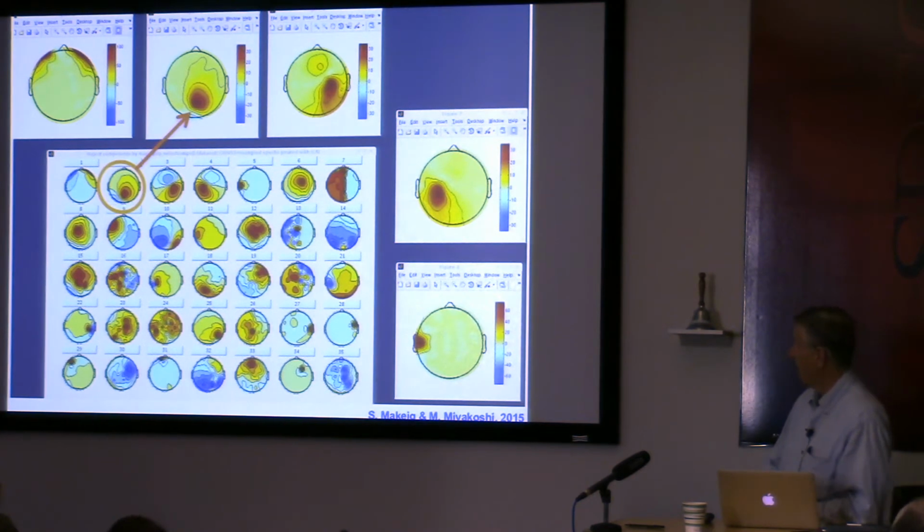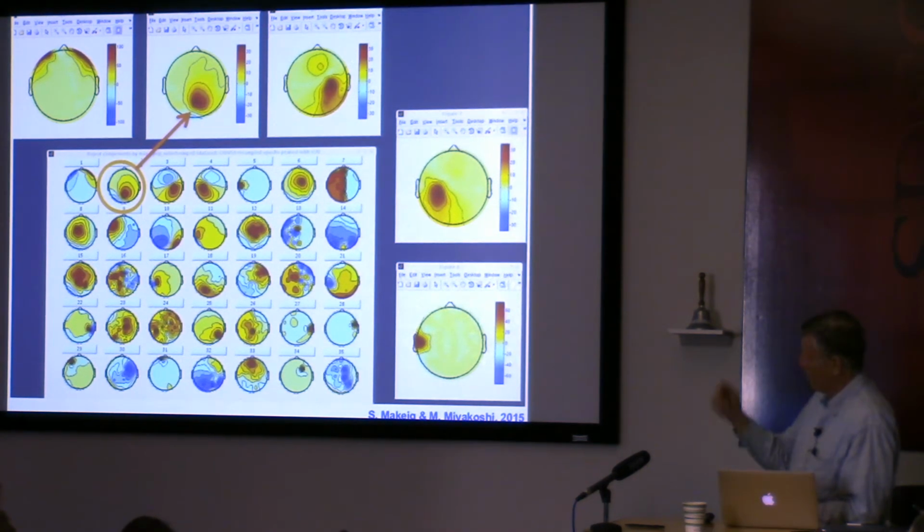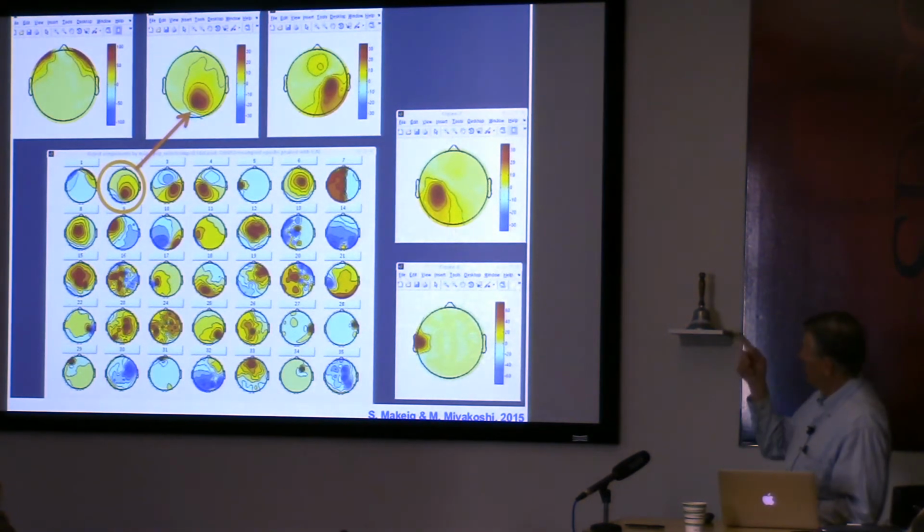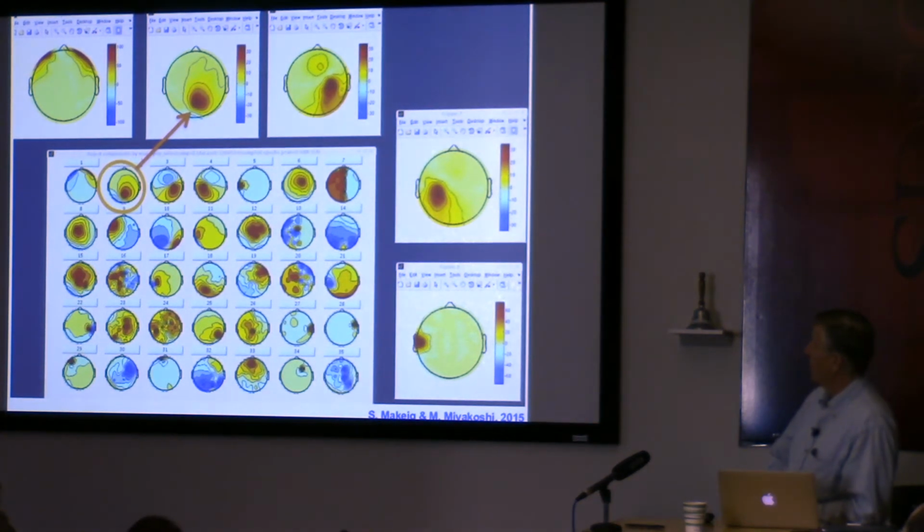Okay. So now, how much do they contribute? This was an effort by Makoto. I asked Makoto to make a plugin you can use that takes different components from one subject's decomposition and looks at how much of the EEG they account for. In the top box there's a map of power, variance accounted for in each EEG channel by that component process.